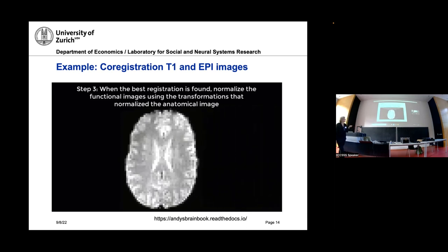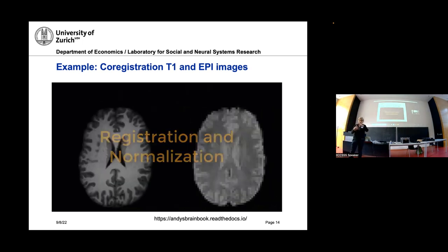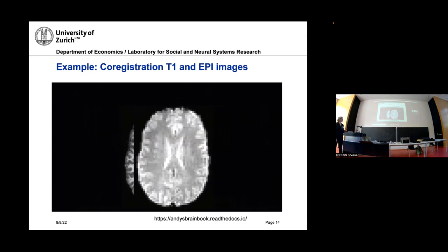And then you also, after bringing them together, and there you really also have to warp and stretch the whole thing. And then you bring both to the template space, right? So that at the end you can compare between different participants.